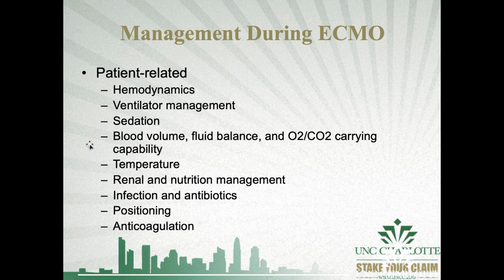So management can be comprised of many different things. It depends on what mode of support you're on. So VV ECMO, management of hemodynamics can get you some places. So let's say you're hypertensive or hypotensive. So you want to give fluid and augment that preload that you're getting with your pump.